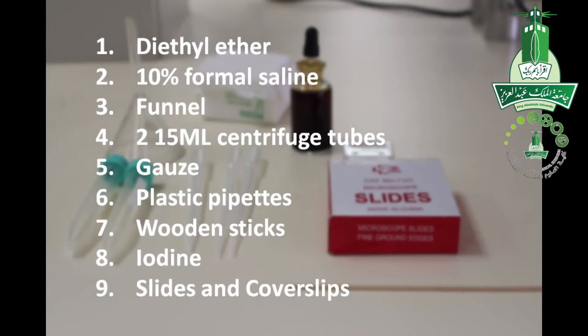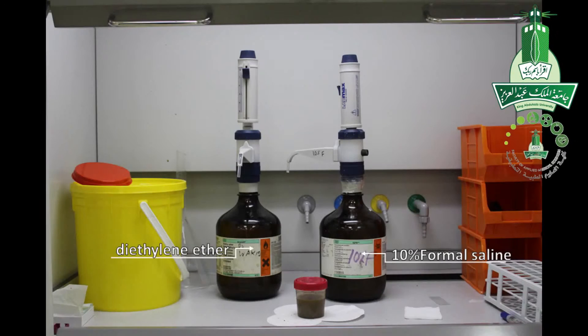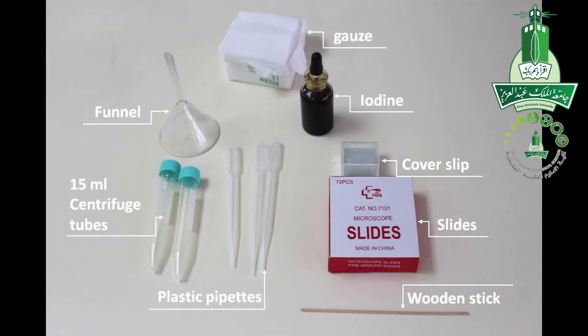Here is a list of all the things we are going to use in this experiment: diethyl ether, 10% formal saline, funnel, 15ml centrifuge tube, plastic pipettes, wooden sticks, slide, coverslip, iodine, and gauze.